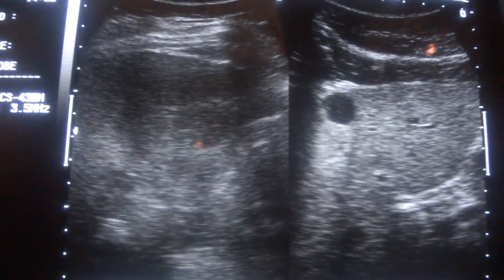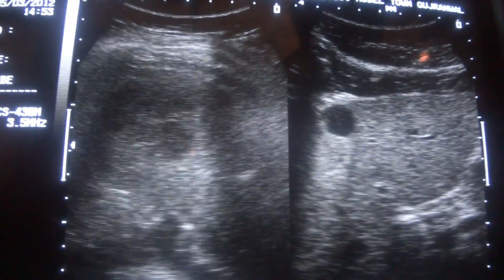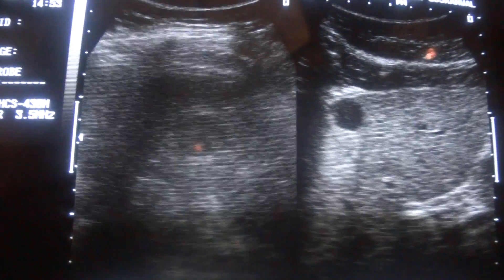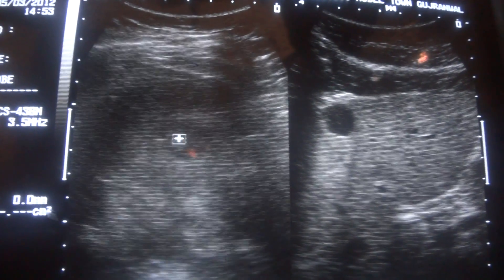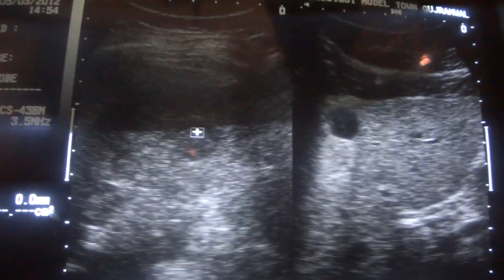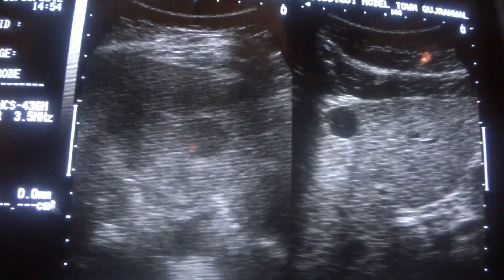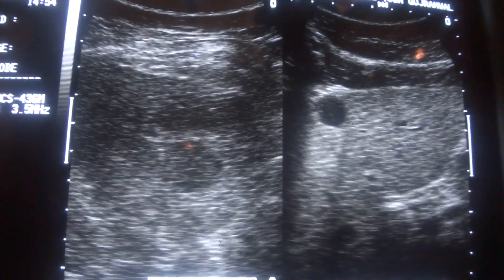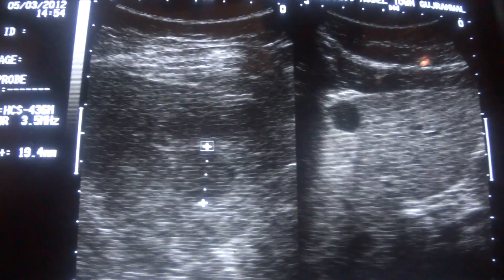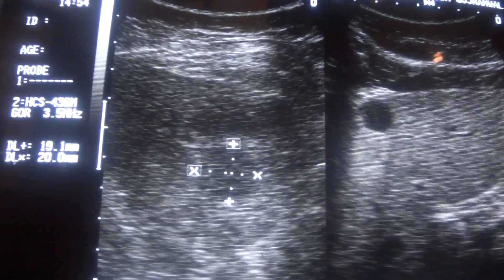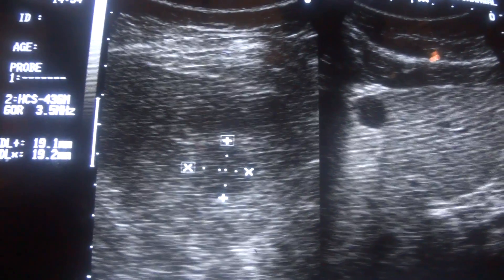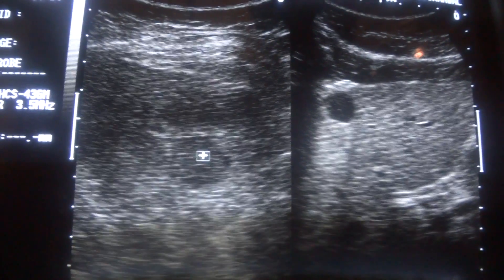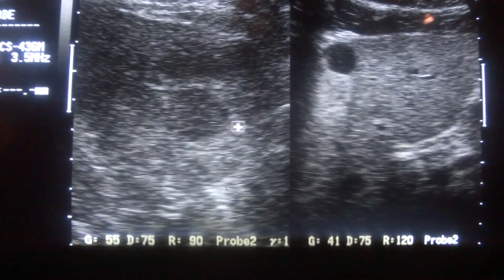I am moving the probe to see if it changes its shape, but up to 90 degrees it does not change shape. Now this is the lesion I am talking about — this one. If you concentrate on this lesion, it measures approximately 19 millimeters by 19 millimeters, is rounded, poorly demarcated, and hypoechoic compared to the adjacent liver parenchyma.